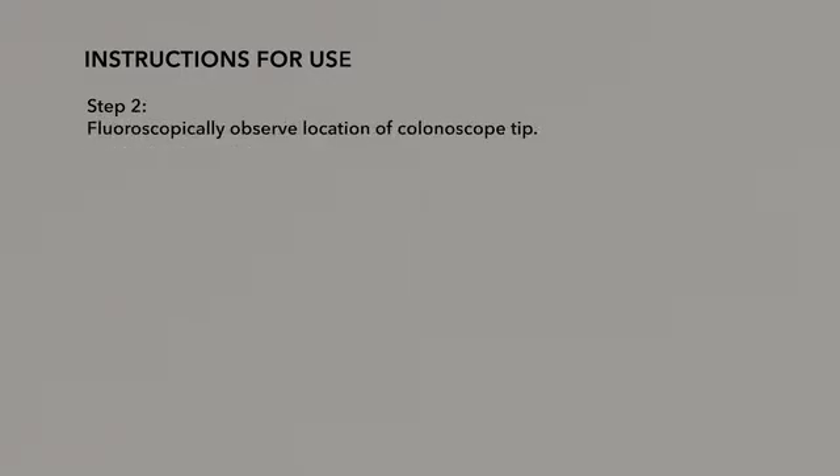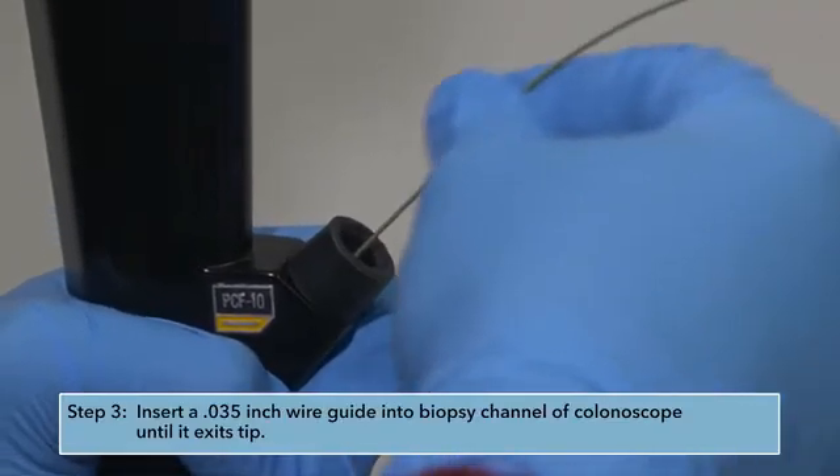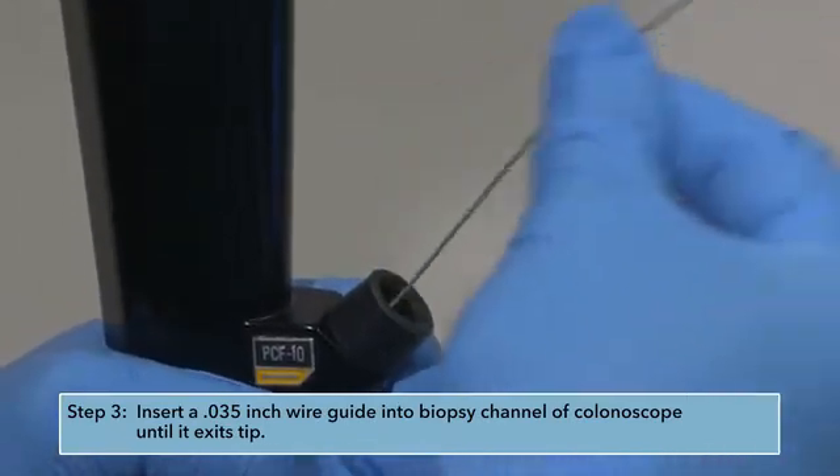Step 2: Fluoroscopically observe the location of the colonoscope tip. Step 3: Insert a 0.035-inch wire guide into the biopsy channel of the colonoscope until it exits the tip.